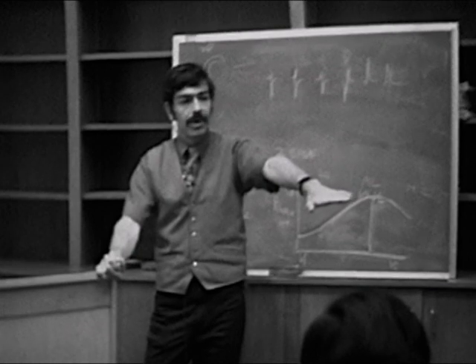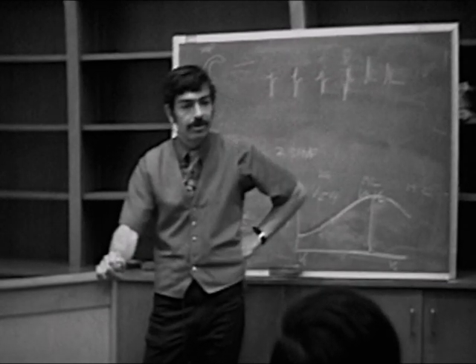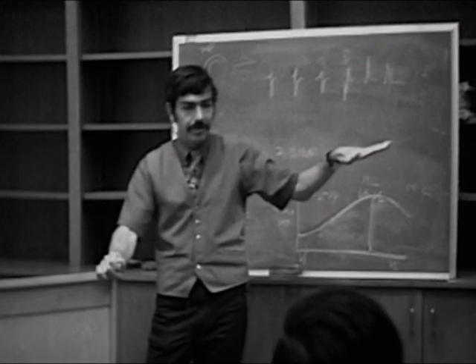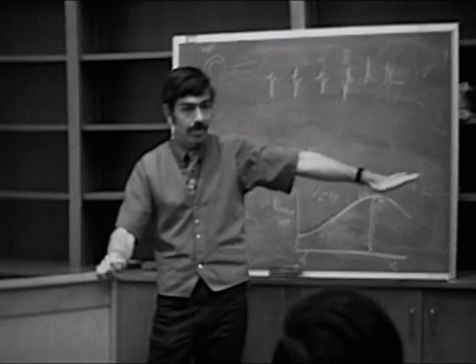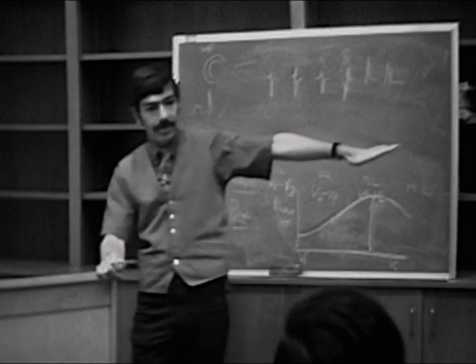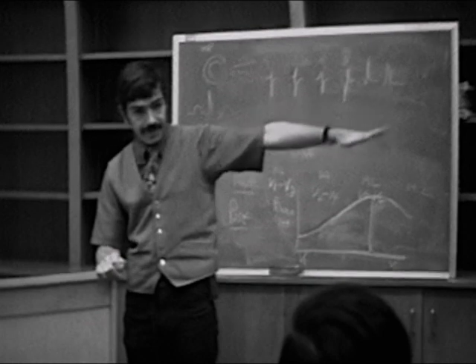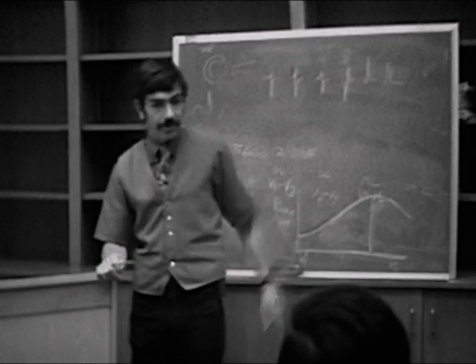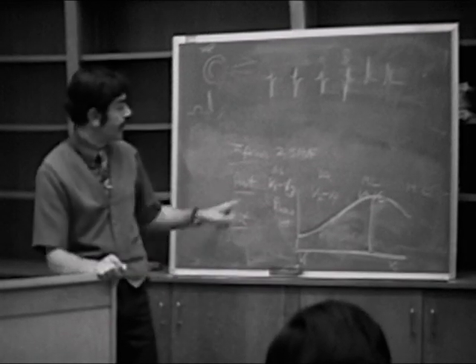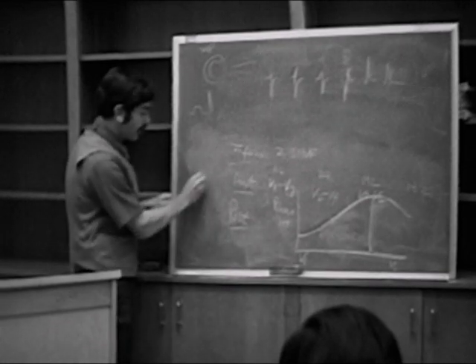Now, what leads in the frontal plane might you also see changes in? What abnormalities in the frontal plane might reflect horizontal plane abnormalities as well? In other words, which lead is pointing in this direction, out in the direction of V6? Lead 1 and AVL, right? So very frequently, in patients who have anterior wall infarcts, we also see changes in leads 1 and AVL.